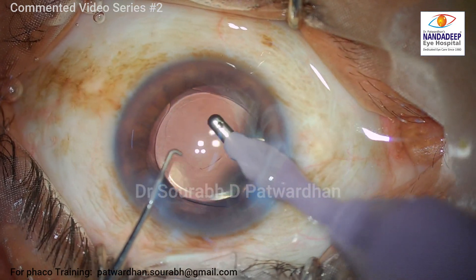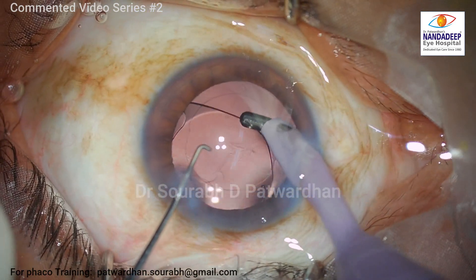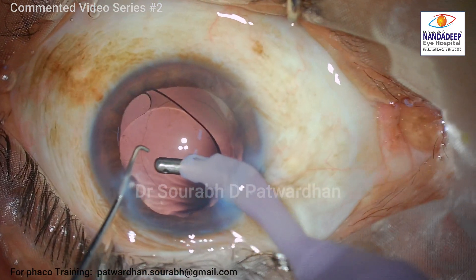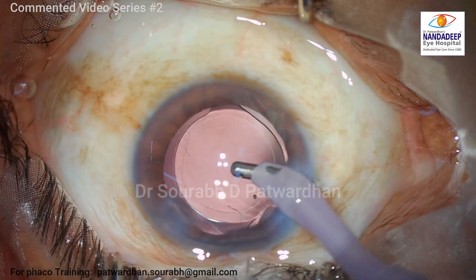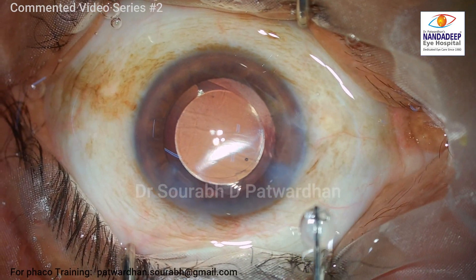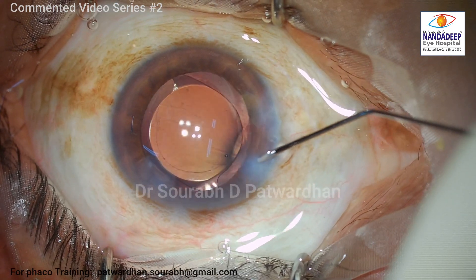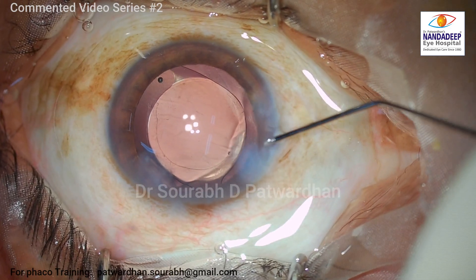These different biometry eyes may have some challenges for IOL measurements. In this particular case I used the Barrett formula, and postoperatively this patient did well with a predictable refractive error. But in cases where there is an excessively deep or excessively shallow anterior chamber, I find that the prediction of the postoperative refractive error may not be as accurate and may have some outliers.